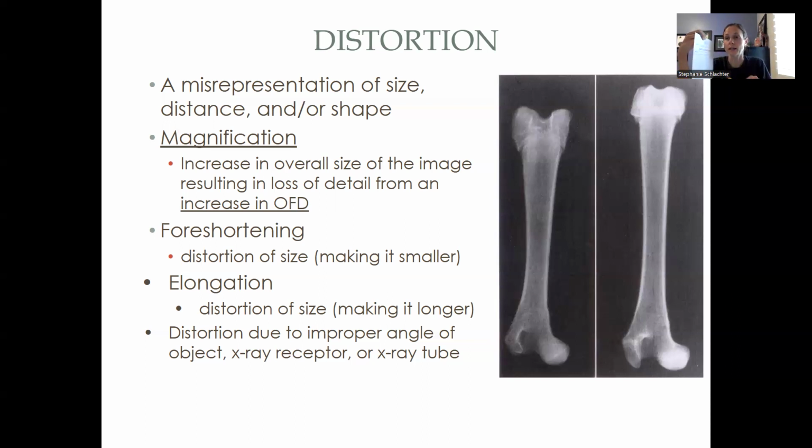And we talked about that, like I said, in dentistry, when we are coming in, because we can't always have things parallel in dentistry, okay? Because teeth kind of get in the way, and the rest of the mouth and all of that, okay?